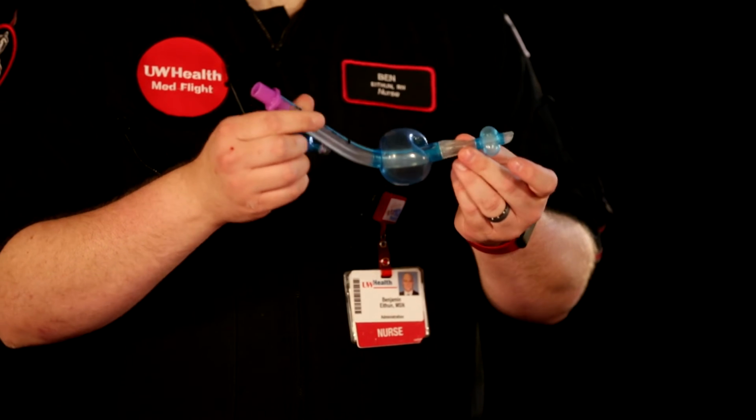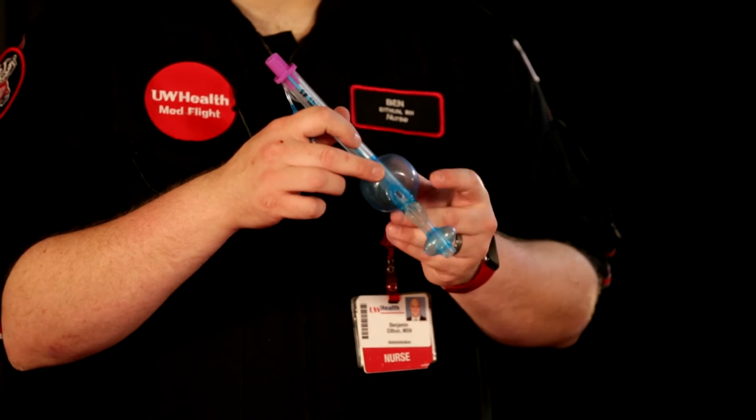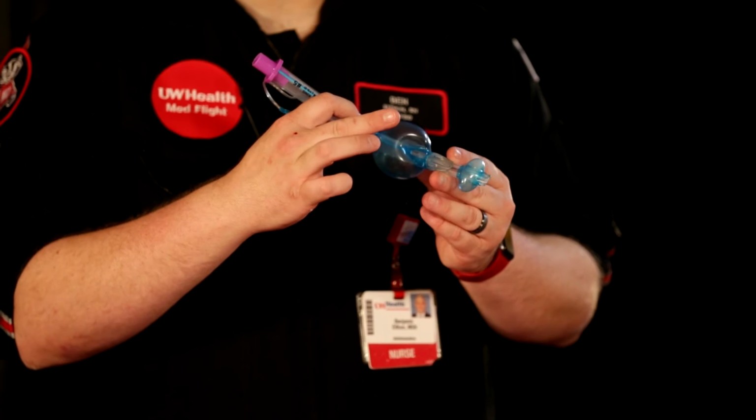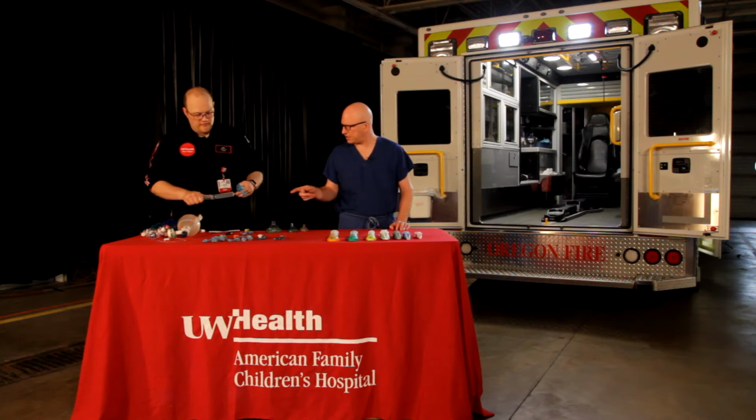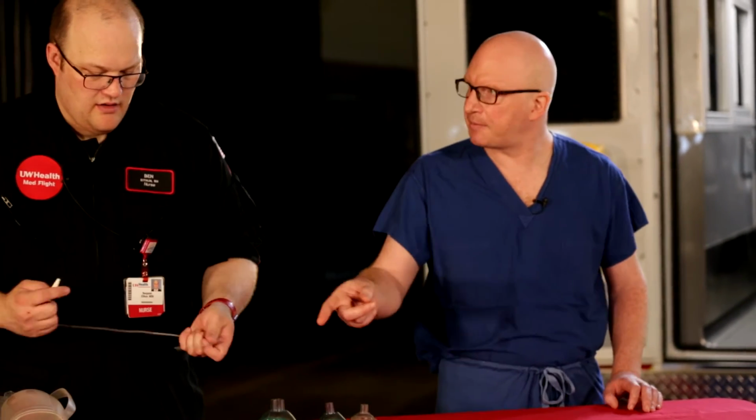So after you get it inflated to the correct size, you can notice the shape. And this is where the air is directed up and again towards the trachea because of this little balloon that's divoted. That's awesome. Something that I learned just recently, actually, is that you can put a suction catheter down at least some of these King tubes.